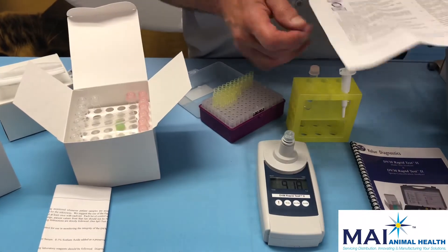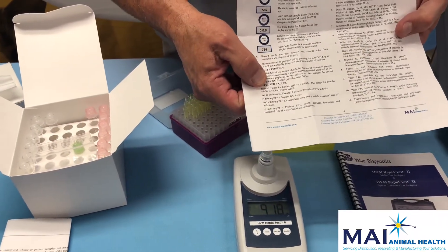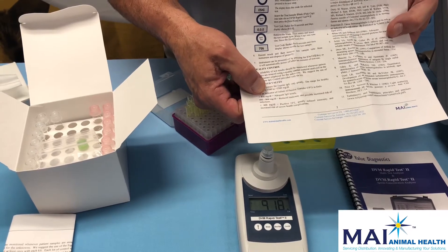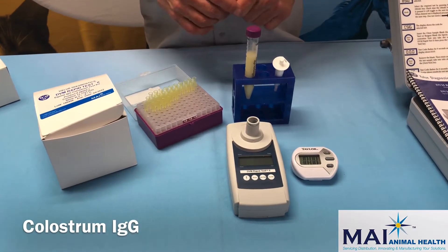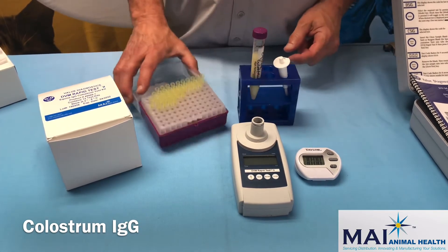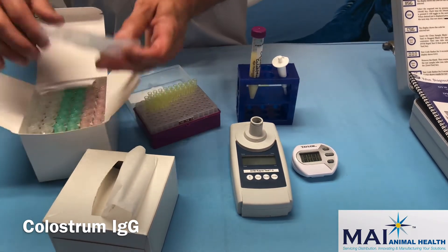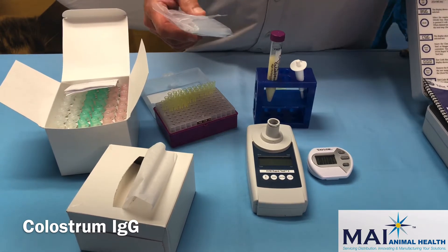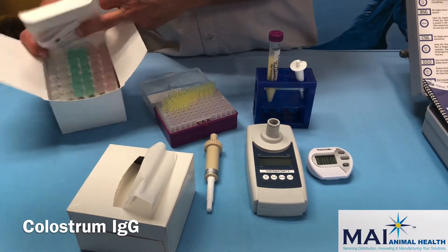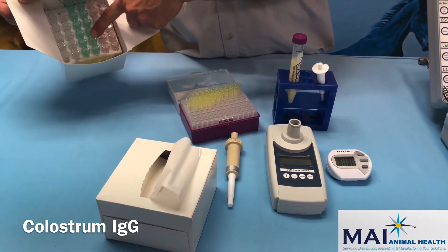One additional note: the product insert explaining the test also contains expected diagnostic values for IgG in foals, indicating appropriate and diagnostic levels. Now we're going to run a colostrum test. We need a colostrum kit, a colostrum sample, the 10-microliter pipette, pipette tips, the timer, and the instrument — along with the 1 mL pipette and white tips.